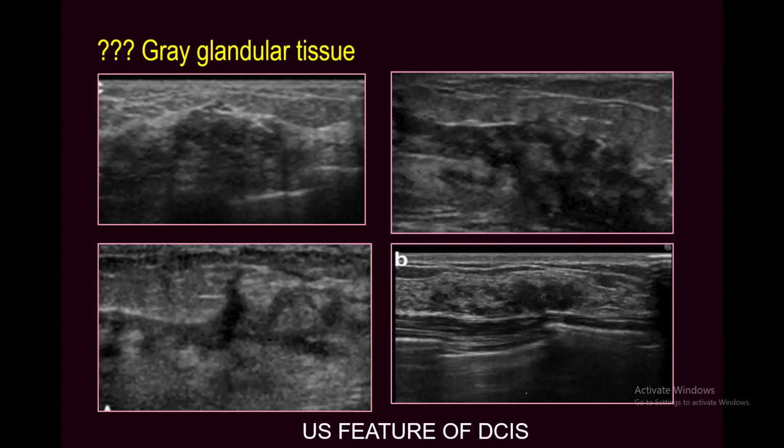Because you located the mass, it can be biopsied. If you found such a lesion in practice, what was the procedure? Was the patient seen again in 3 months? Was the lesion biopsied under guidance? What used to be practice?